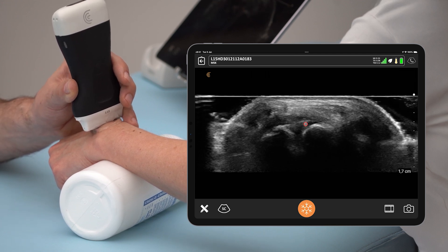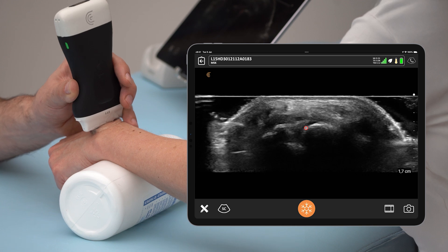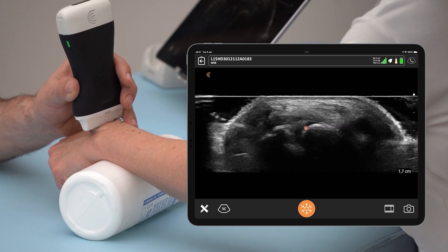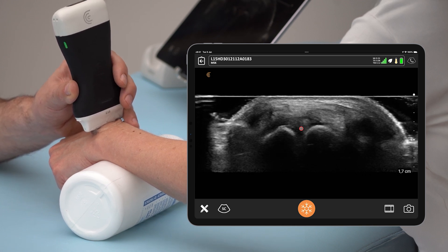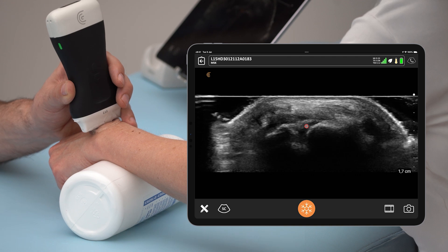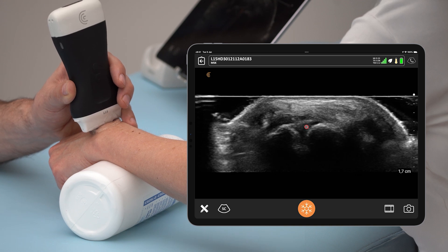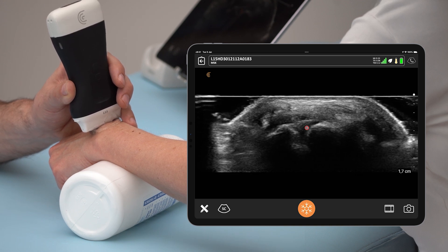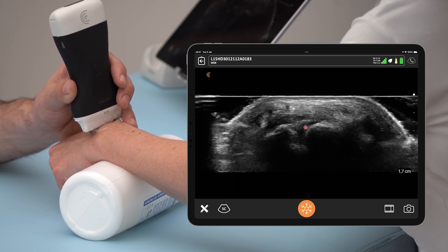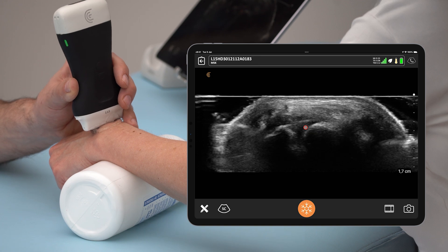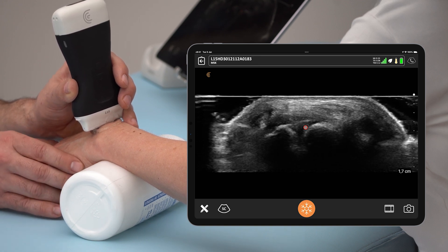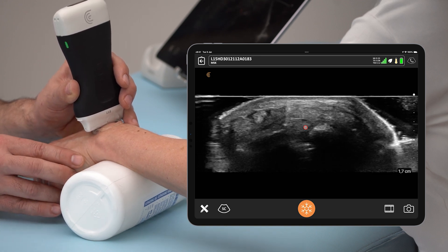In case of a ligament tear, you may not see the ligament at all, or you may see a ligament that contains a tear, which will appear anechoic. The best way to test scapholunate stability and the ligament is by placing the patient's hand into ulnar deviation.